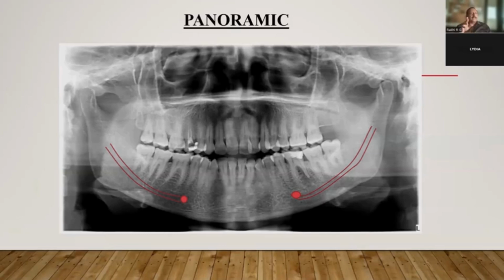So your idea will be to hemisect the distal portion and place an immediate implant in that region. Okay, the other fragment of that tooth, that is the mesial portion, has to be kept completely out of occlusion, not to disturb the distal root socket. And then wait for it to heal completely. Then go for the same protocol, considering this tooth as another premolar, and connect it. So this will be a tooth-implant prosthesis, a tooth connected to the implant. An implant is not considered to be an ideal candidate to be connected to a tooth. There are a few conditions applied here.